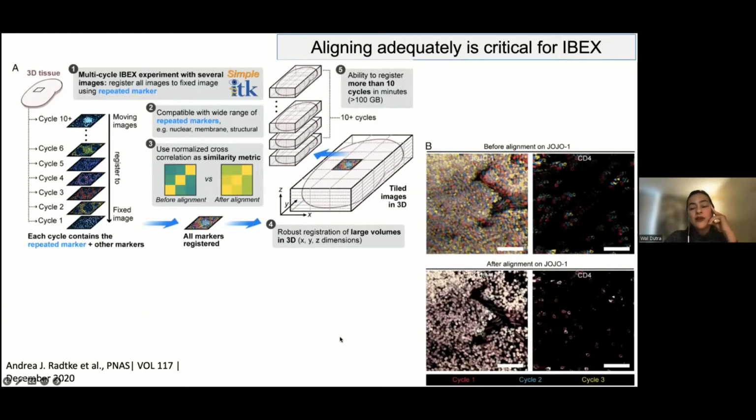Just as a reminder, when I was reading the Chagas heart samples, we read about 5 fields per sample, and that took about 40 to 50 minutes per sample to read. So it takes a long time, because remember, you have as many channels as you want to use.